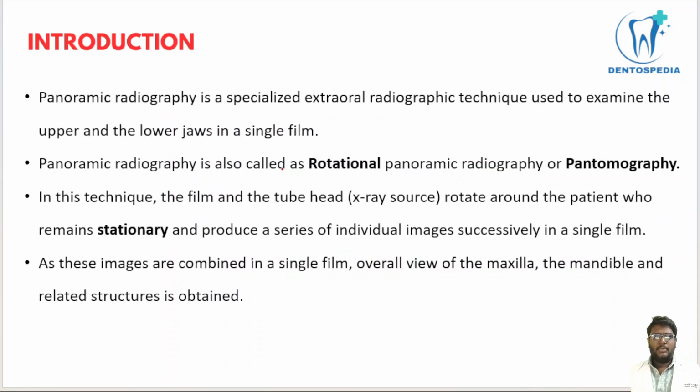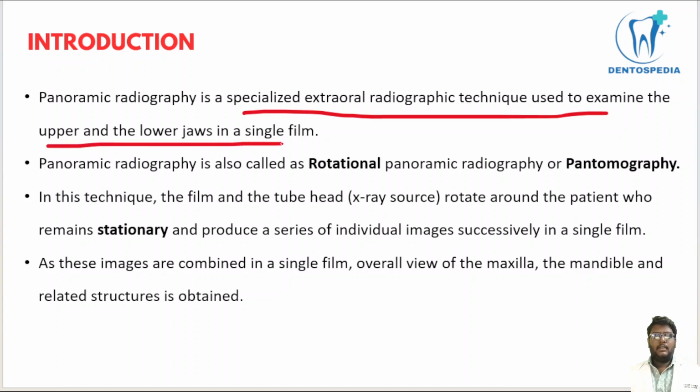Coming to the introduction to panoramic radiography, it is a specialized extraoral radiographic technique. It is one of the radiographic techniques used extraorally. What we are getting is both jaws, maxilla and mandible, in a single film. That's the specialty of the film. It is also called rotational panoramic radiography or pantomography.